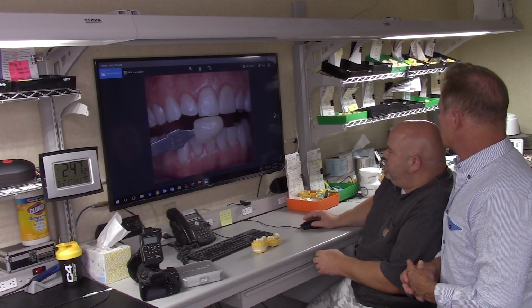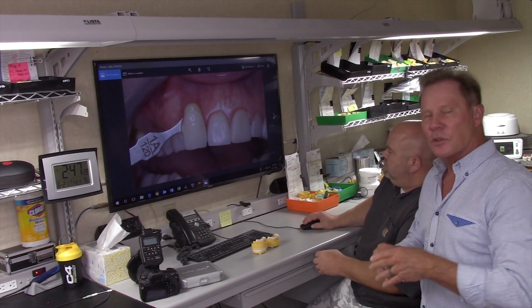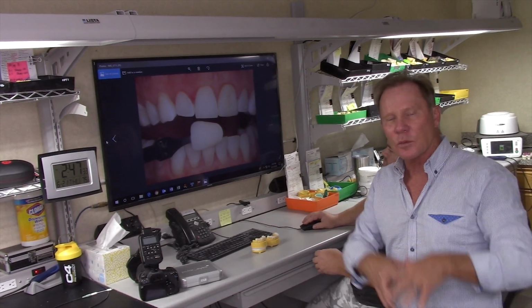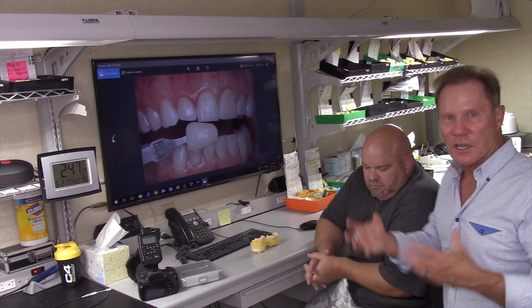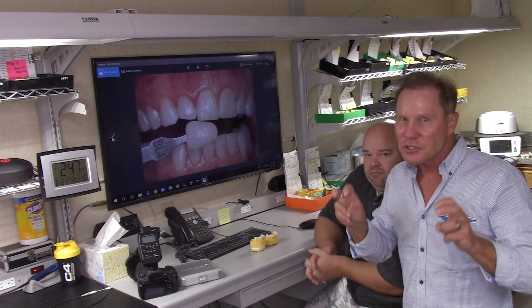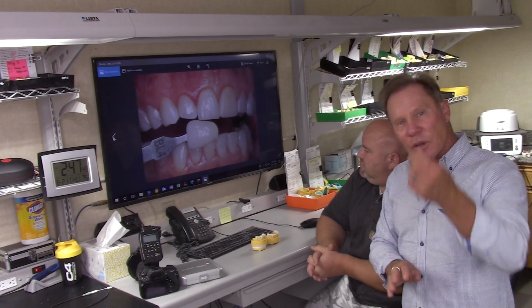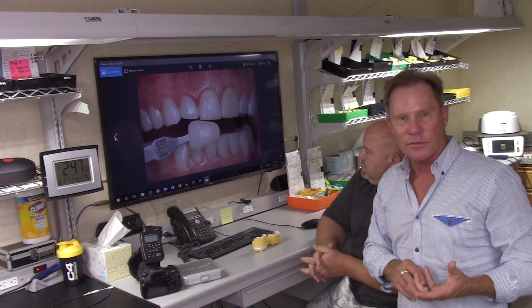So this is nice. The other thing that I found really valuable, and I know that you shared this with me, is we get a crown back or a veneer and it's the wrong shape. We've all had that happen. That's why I think both Phil and I, he as the artist ceramist, and me as the clinician, one of the least favorite things that we used to do, I actually enjoy it now, is trying to match a single tooth. So we get that restoration back, we try it in, and it's a little bit off.